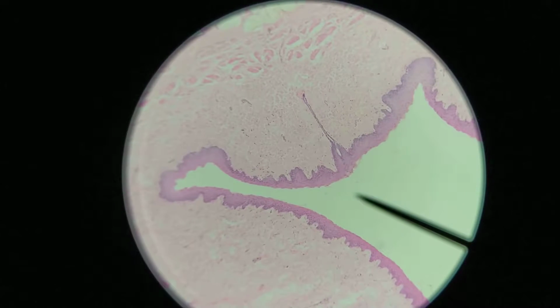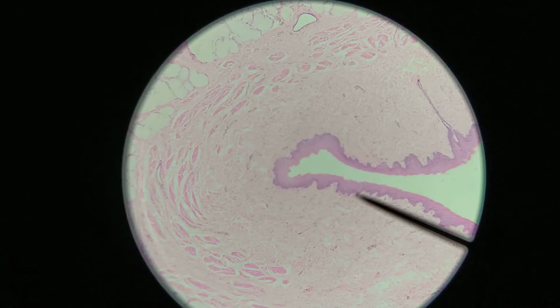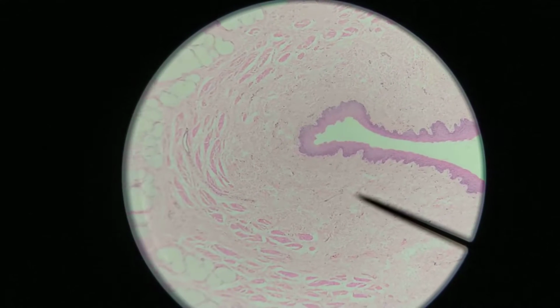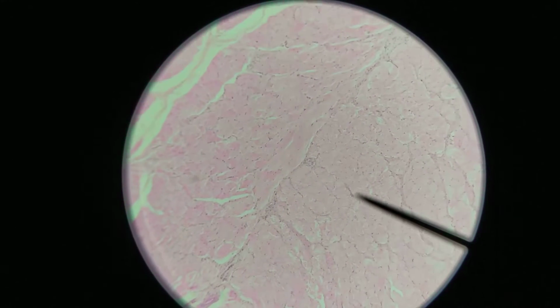In this slide we'll be looking at a section of the esophagus. Now this one is a little unusual in that this section is not actually a cross section through the esophagus. It's actually a longitudinal section through the esophagus. And so right now it doesn't really look like there's any evidence of that, but when we go out to some of the outer layers of the esophagus, we're going to notice that the arrangement of muscle out here, for example, is a little unexpected.